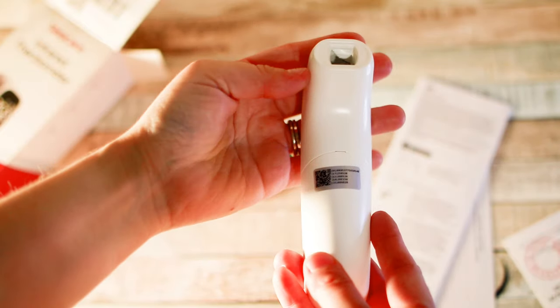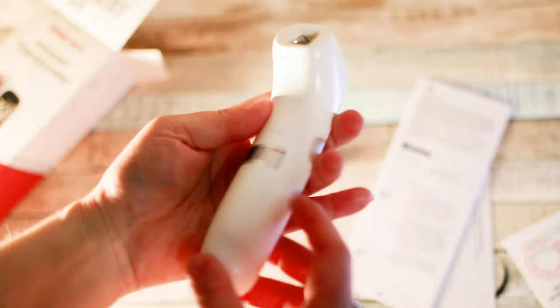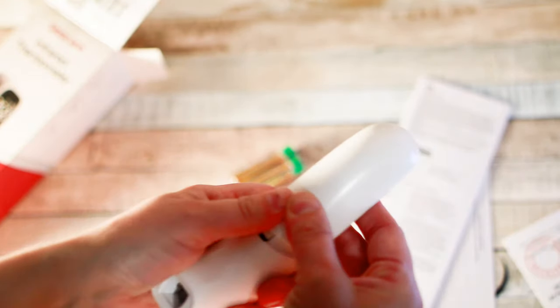You can see it's compact in size, pretty lightweight. There's a button right here, and that's where your temperature is going to be taken, and a little battery spot — it just slides right off.